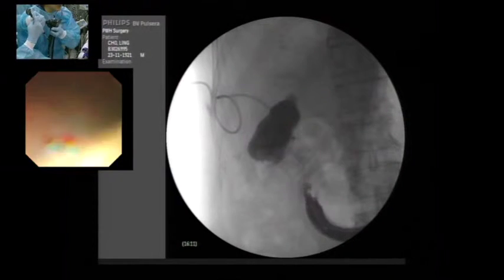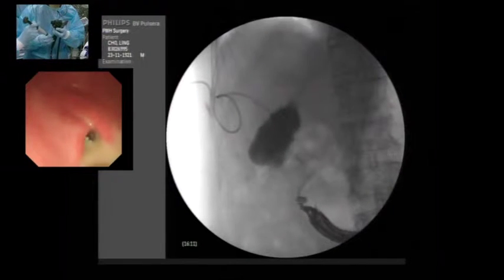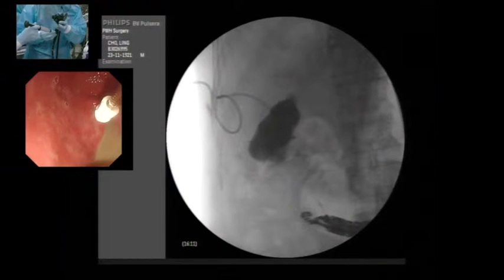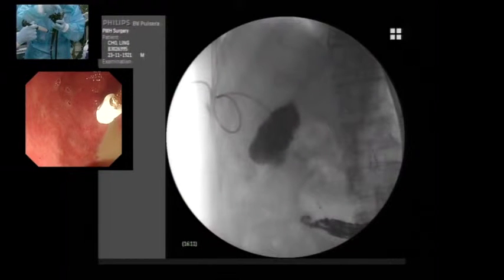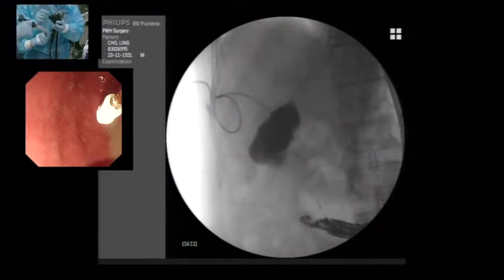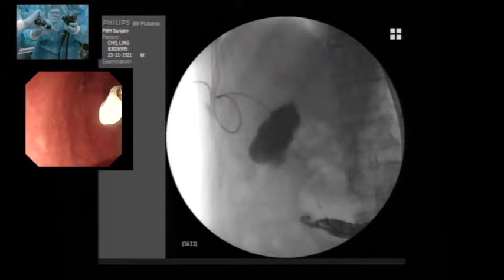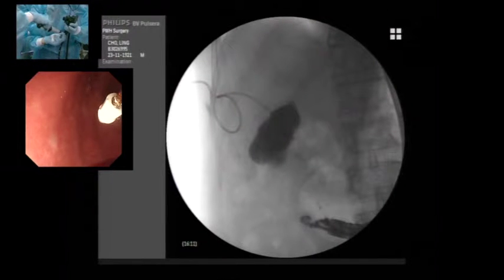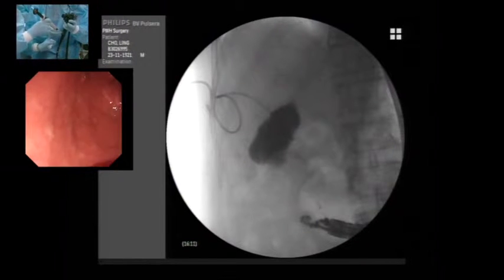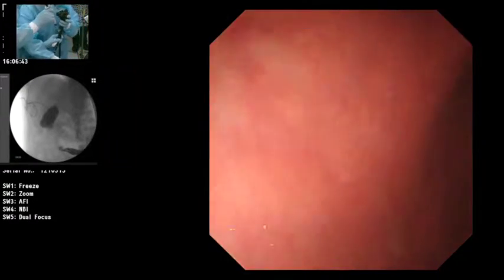Tom, if you can just show the tip, the ceramic. Let me see if I can just show that. It's just a little bit hard to see. I want you just to see that. Do you see that tip there? See the wire running along the side? That's that diathermic wire that gave me that cautery that enabled me to very smoothly, even though this is 10.5 French, advance the catheter into the gallbladder. You can do the same, of course, with a pseudocyst. Yeah, got it. Or the bile duct.